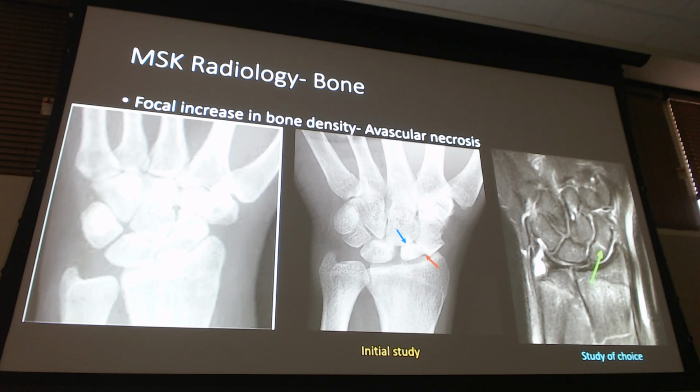This MRI in particular is of a patient who had multiple normal x-rays, but they were still having pain, that process I told you about. Come back, got another x-ray, it was normal again. Okay, wait another week, come back if it's still bugging you. They came back, it was still bugging them. They got an MRI, and the MRI makes that fracture jump out right there, that scaphoid. This patient is likely still going to get surgery. I'll let ortho focus in more on that next semester.